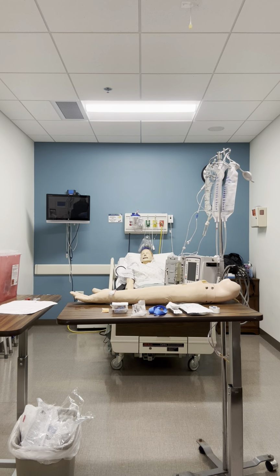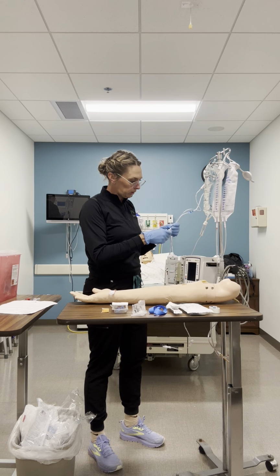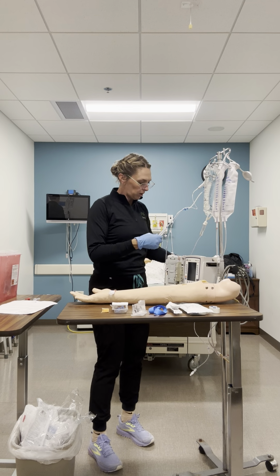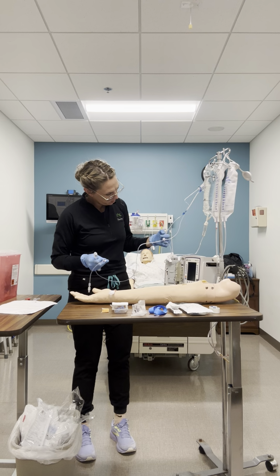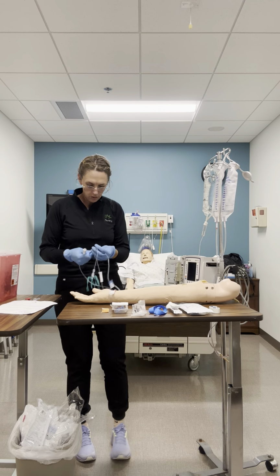This would not be something that I would do, but I have to do this because this is where we are. So I'm gonna go ahead and see if I can get it started by that, or if we need to go lower.